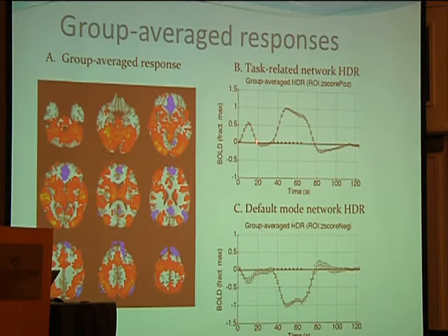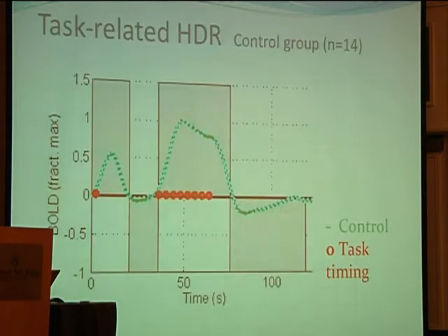And so all the red voxels contributed to this response here. And now this response is actually an average response from all blue voxels. As you can see, it's almost exactly the reverse of this positive response. So this is just a zoom in on the general response of all the red voxels.